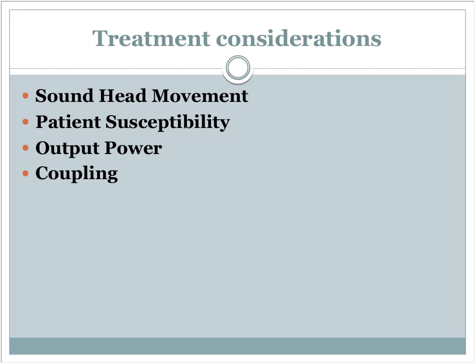And to me, I think ultrasound is really a heating modality, because I don't see what else it's doing if you're not heating something up. And some literature supports that and some doesn't. So it's kind of a little bit more my personal opinion on it. But I use it as a heating modality. And if you're trying to cover too much of an area, you're not heating anything up effectively. So you need to keep the sound head moving.